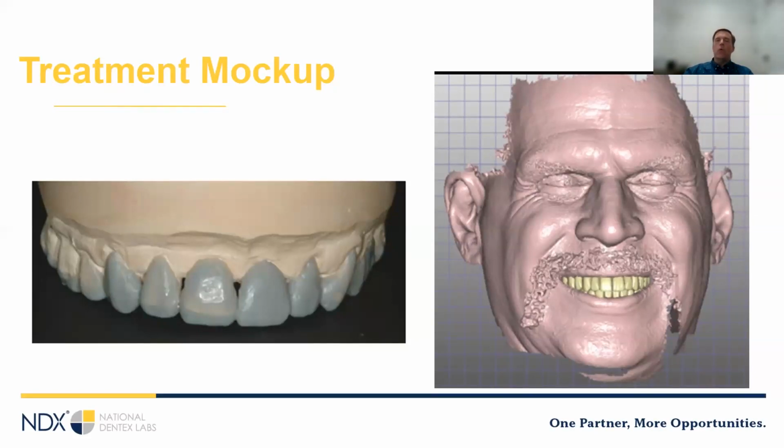We've talked about overlaying for the patient, and this is the stage where we want to get that overlay done. If there's any way, especially if we're, say, adding a little bit of bulk on the facial surfaces or something like that, it can be really nice to scan the existing teeth, design a thin PMMA shell, and actually bond that to the tooth. And then the patient can see what we're talking about.